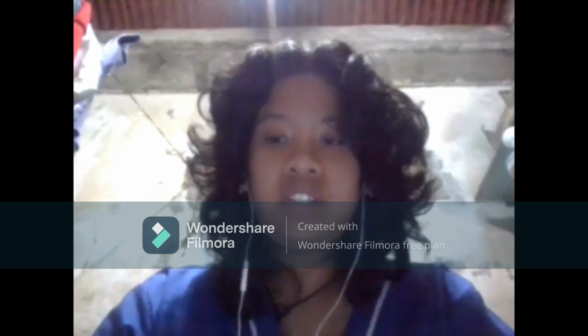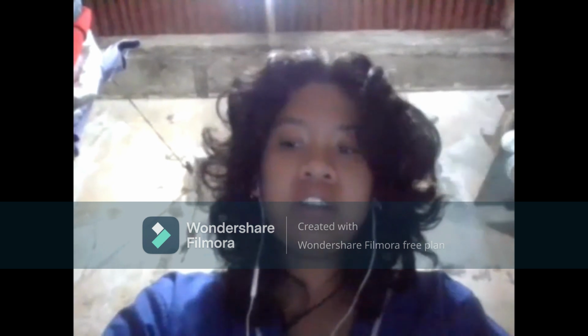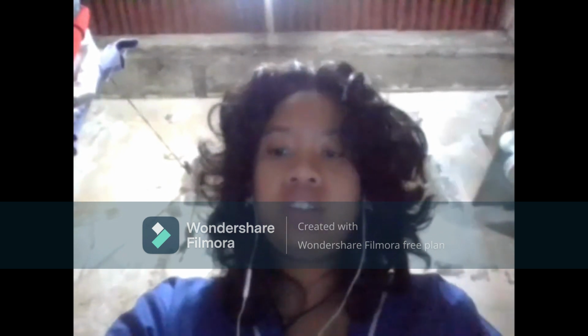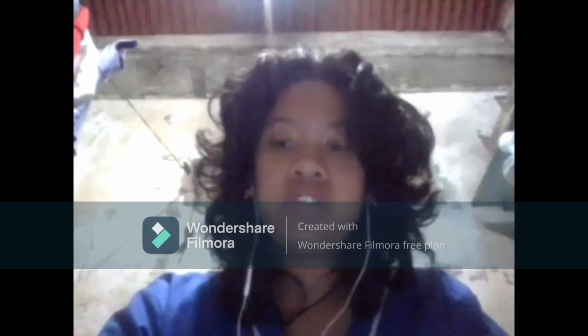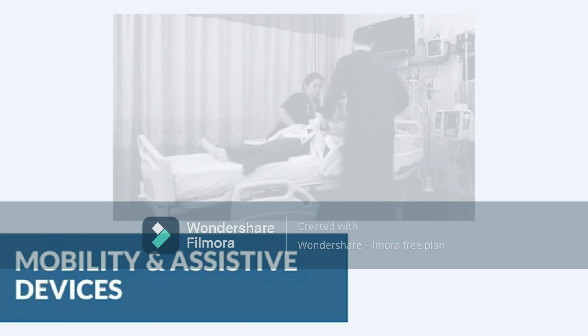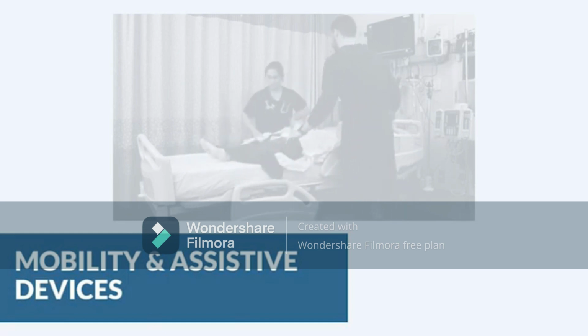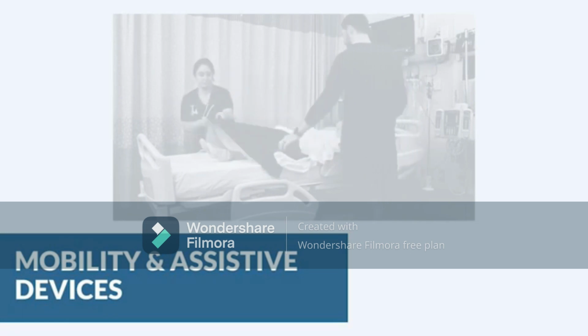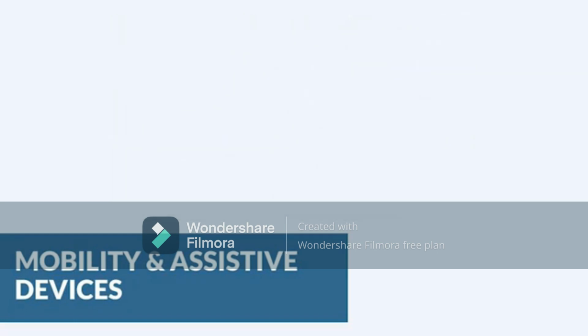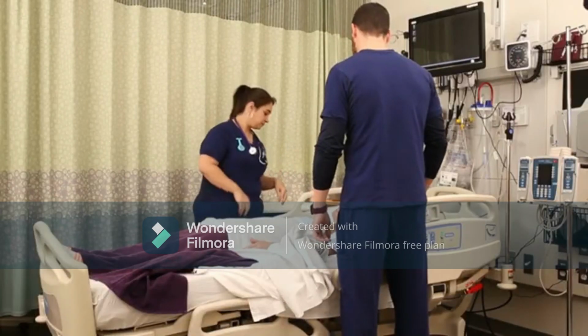Assistive technology. Assistive devices are the external devices that are designed, made, or adapted to assist a person to perform a particular task. In this video, we're going to look at a few highlights in patient mobility: moving a patient up in bed, getting a patient out of bed, and the use of assistive devices like a cane, walker, and crutches. So first, let's look at moving a patient up in bed.